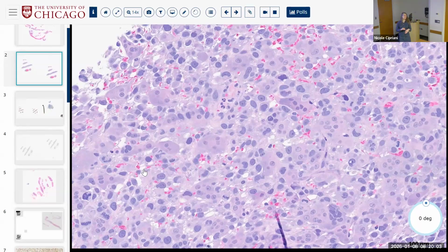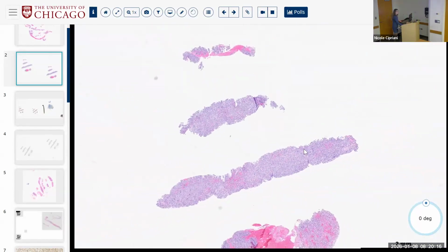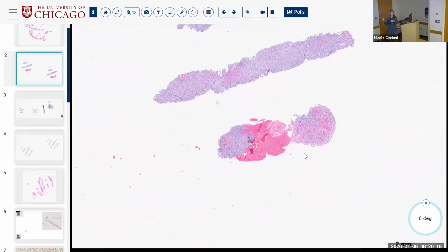All right, so this is one of the known morphologic variants of undifferentiated sarcoma, right? That is just giant cell rich, okay? So if you pull up your WHO chapter on undifferentiated sarcoma, you'll see that giant cell rich variant is one of them, right? So we cannot necessarily prove that it is related to any benign giant cell tumors. It in and of itself just recruits giant cells.